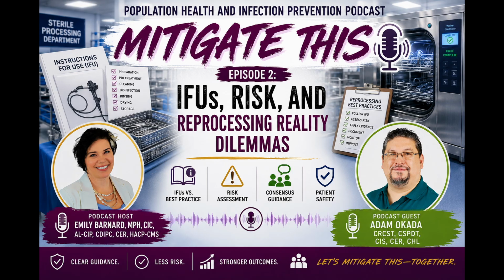What if that piece breaks off? What happens? And what I think about is a lot of people are really overwhelmed by the number of pages in an IFU. It could be this simple device has a 200 plus page instructions for use. So, what point of that is actually a value to sterile processing and really looking at the infection preventionists as well? What I find is that there's different sections that are really important.